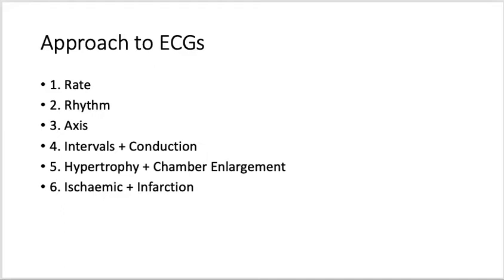All right. Now that we have an understanding of the basics of what an ECG is actually looking at, of course, there's a little bit more to it than just knowing what a P wave is. We need to put it all together and understand what it means for the patient when you're actually reading their ECGs. As I previously mentioned, there are many different systems to interpret ECGs. This is the one I try to use. If you don't like it, that's fine. You won't hurt my feelings.